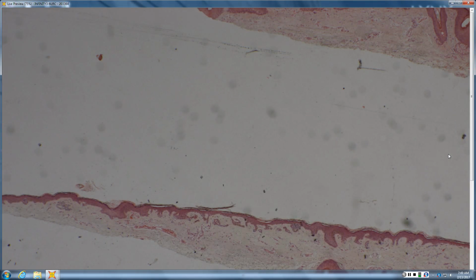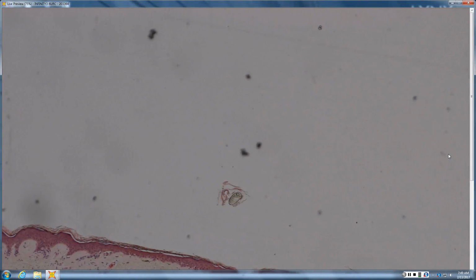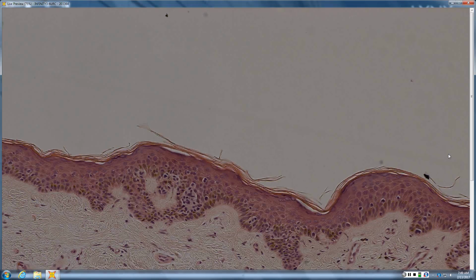They were usually looking for MF or LM, right? And MF is usually not going to be on the face. A little nest right there. And then just some irregular nesting throughout. But there's not a great pigmented proliferation that I can see. There's another nest right there. No, exactly. So this is not something that jumps right out at you. But talk me through it.